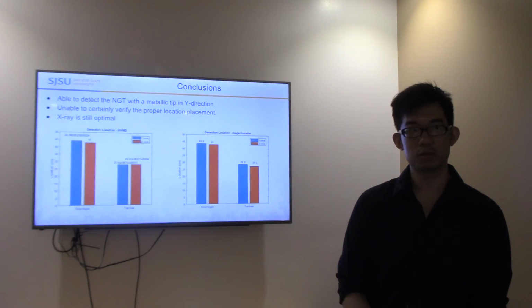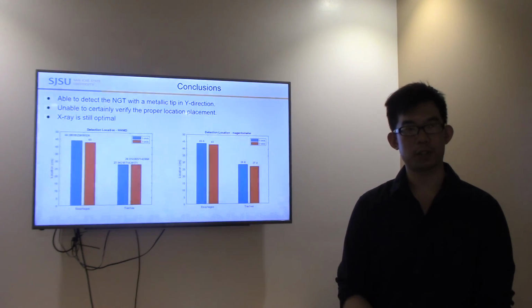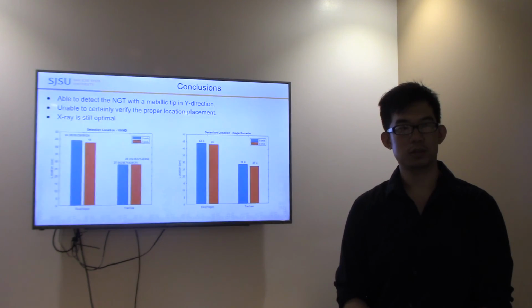So you took those measurements in the beginning on the adult person, so you'd say there'd be a range of distances from here to here where you should see your metal piece and where you shouldn't, is that right? Yeah.